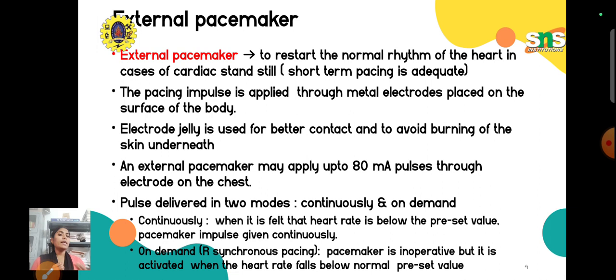It gets operated when the value goes below the preset value; only then will the pacemaker get activated. Once again, the pacemaker is initially in an inoperative mode.